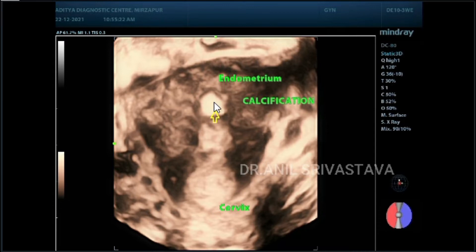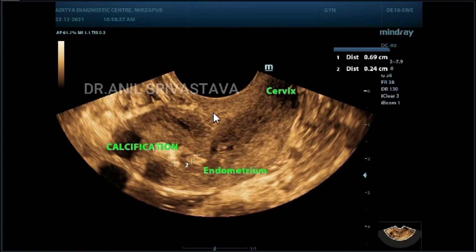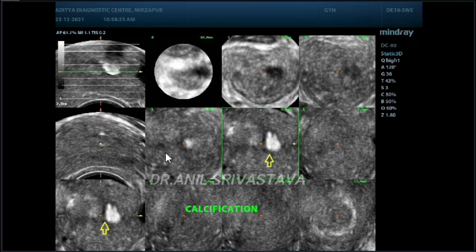You see here, this is calcification. You can see this is the cervix and this is endometrial calcification. This acts as an IUCD.